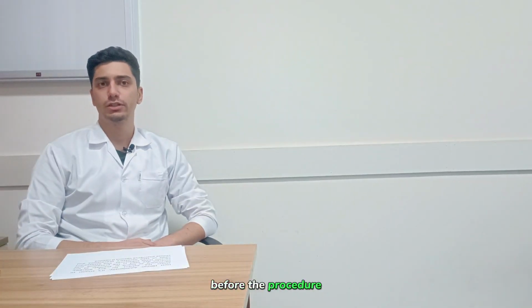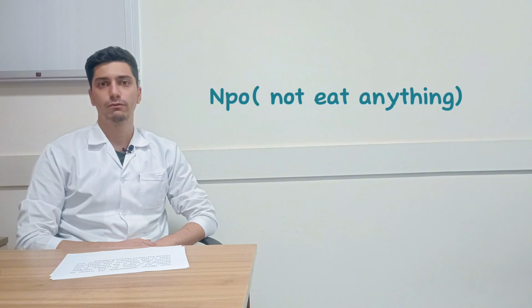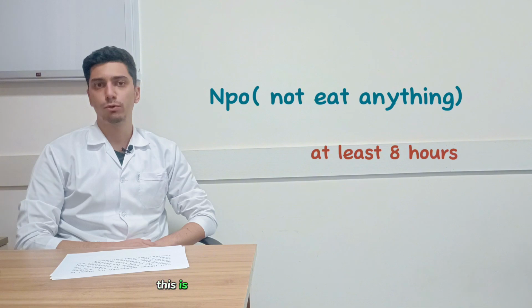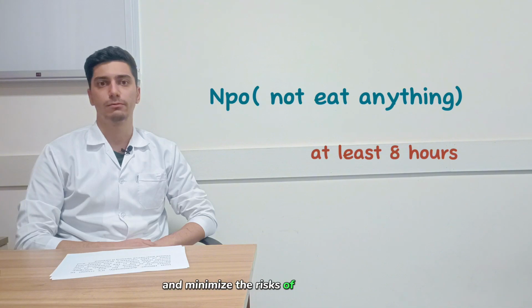Before the procedure, there are a few key things to remember. First, ensure that the patient has been NPO for at least 8 hours prior to the coronary angiogram. This is important to ensure accurate results and minimize the risks of complications.